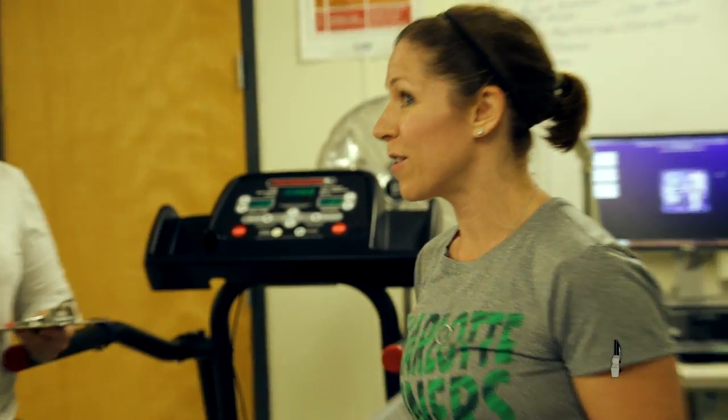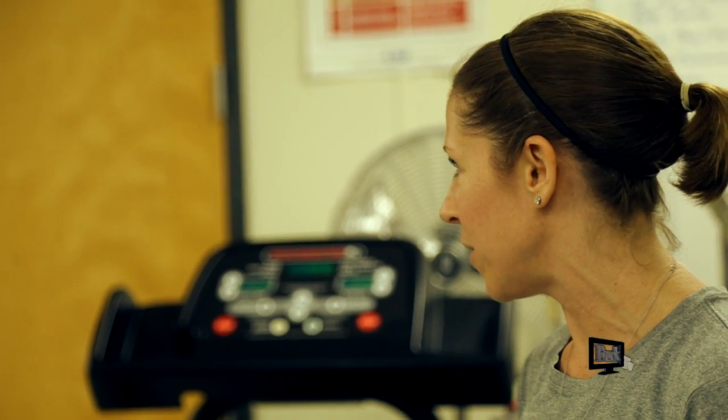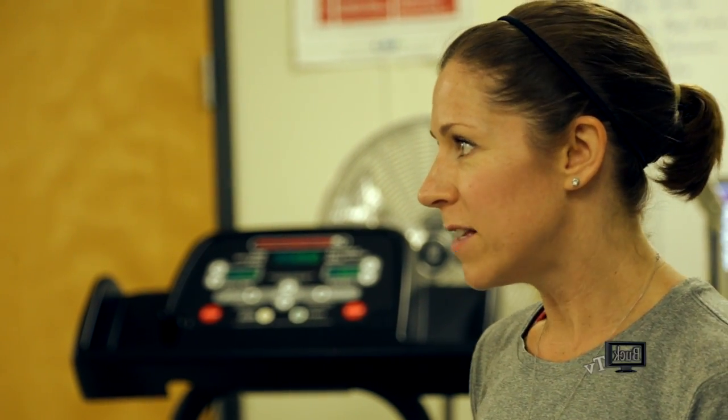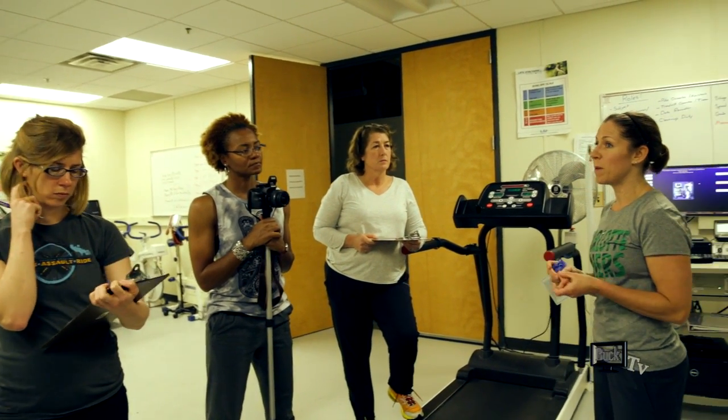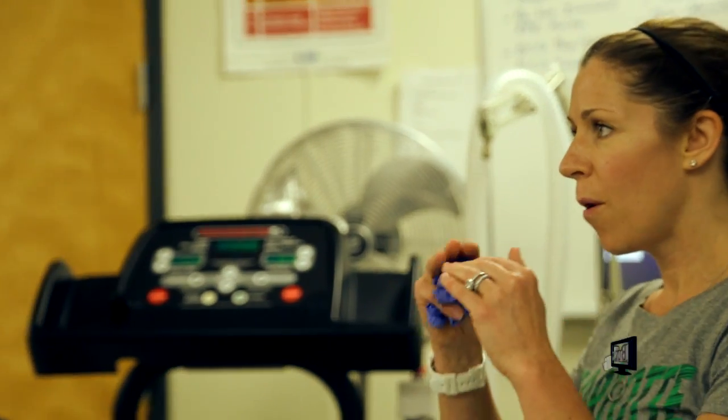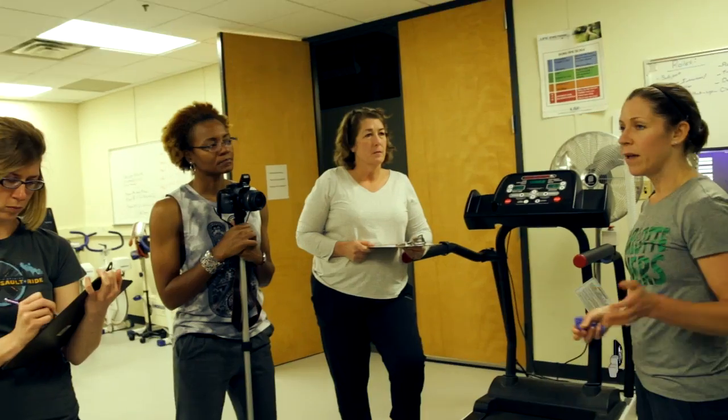Aerobic fibers can use it, and his circulatory system can clear that lactic acid, right? So at some point it's going to start to build up. So we've all felt that, right? It's when you start to feel a little bit at the onset of fatigue, it gets a little more uncomfortable, you start to breathe faster and heavier. So what we can do is during each stage, we have him hop off the belt for maybe 10 seconds, get a really quick blood sample, get him right back on the treadmill, and then measure his blood lactate. And it helps us to confirm where his lactate threshold is.